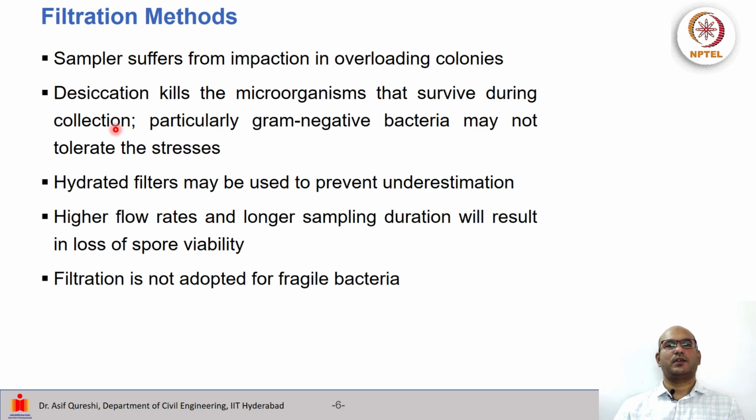So we need to somehow prevent the desiccation of the microorganisms. In particular, gram-negative bacteria may not tolerate these kinds of stresses. So in this case, probably hydrated filters, or filters that may prevent or minimize the desiccation, may be used to prevent the underestimation.